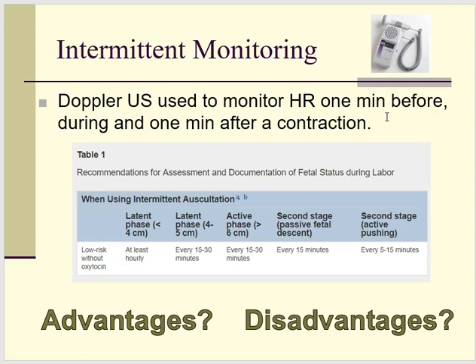Some advantages to intermittent monitoring: it considerably frees up your mom's mobility. She's not attached to things, she's able to move around, she can get in bed, out of bed, in the shower, wherever she feels most comfortable to be. Disadvantages to intermittent monitoring: it's not continuous. We can't always get a good baseline, which we'll talk about later.